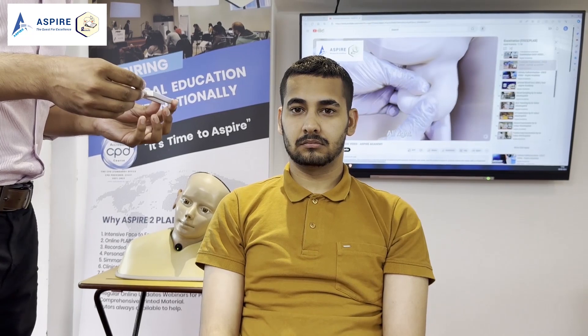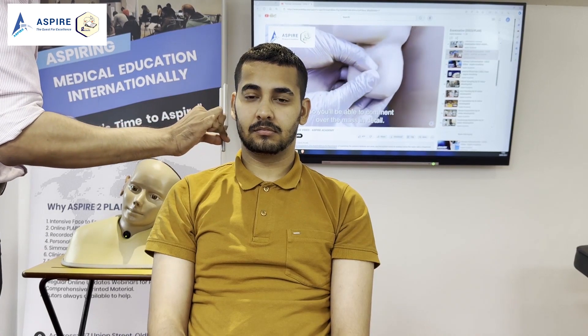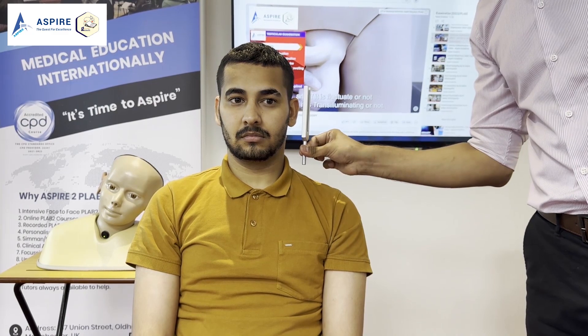Let me demonstrate conductive hearing loss as well. John, I'm going to buzz this instrument again and place it behind your ear. Tell me when it stops and then I'll bring it in front. Can you hear it? Yes. Tell me when it stops. Stop. Can you still hear? Yes. So air conduction is more than bone conduction on the right ear. Now let's do the other ear. Can you hear? Yes. Tell me when it stops. Stop. Can you still hear? No. So it means bone conduction is more than air conduction — most probably my patient has conductive hearing loss on the left side.